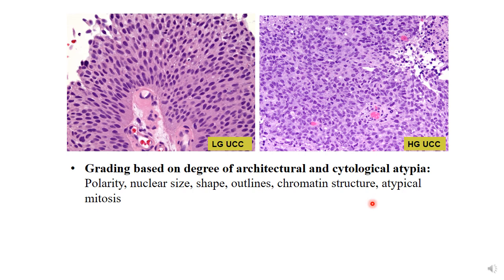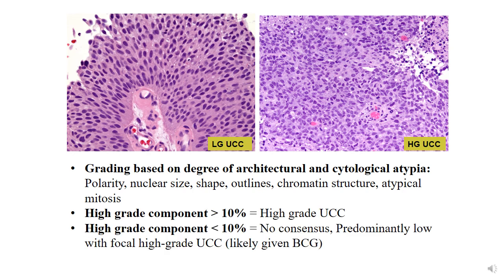In general, low grade has very minimal or mild abnormality, while high grade processes typically have more low power recognizable atypia that you can appreciate. Sometimes you may have uniform nuclei, but numerous atypical mitoses, nuclear crowding, and hyperchromasia can be seen. All of those features now fall more into the high grade category.